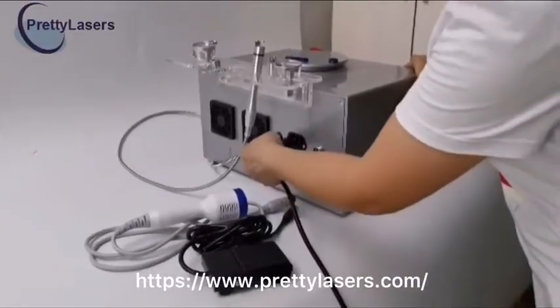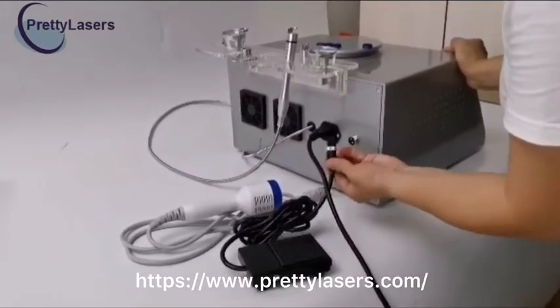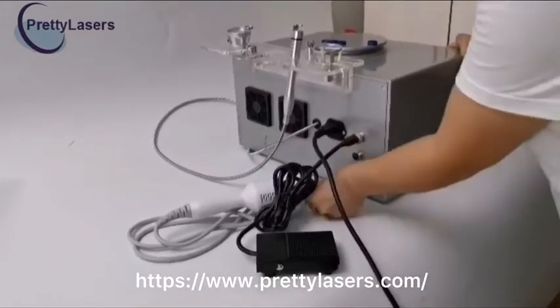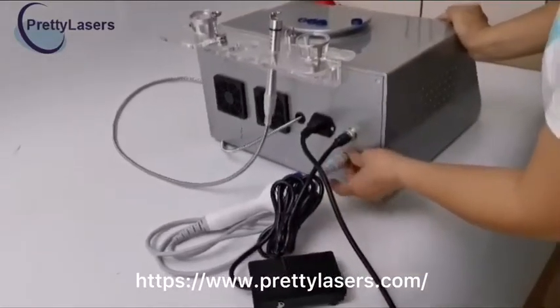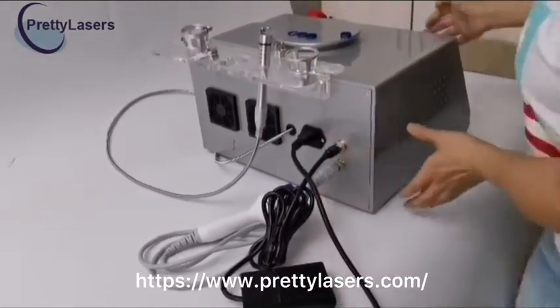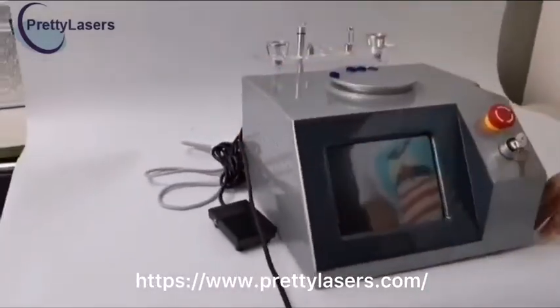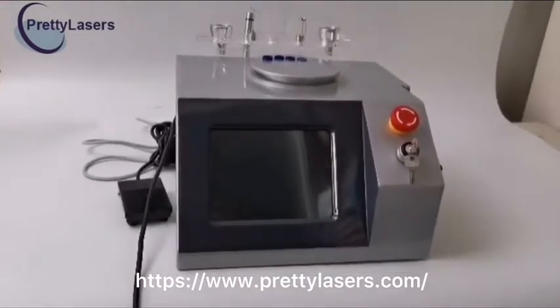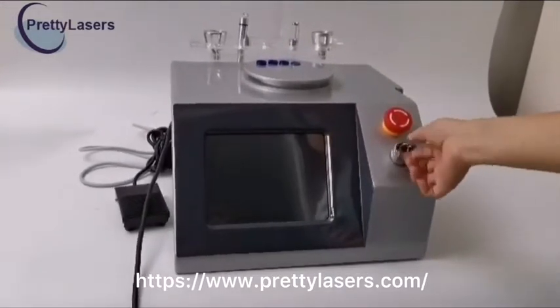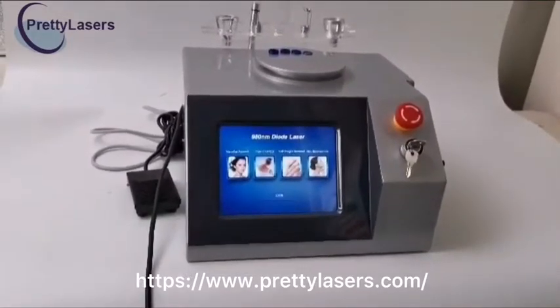Connect the power cord to the power socket. Connect the foot pedal wire to the foot socket. Connect the hand piece to the eye socket. When connected, the machine may be switched on without adding water. There is no consumable material and no maintenance needed. Now turn it on. It loads automatically into the main interface.